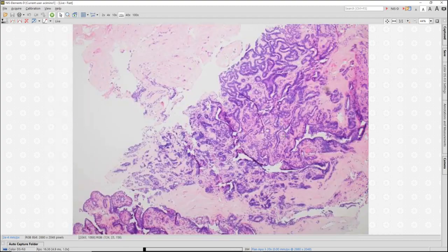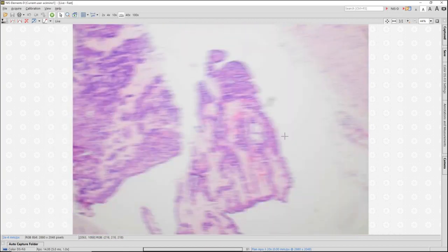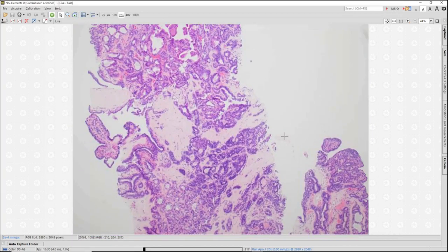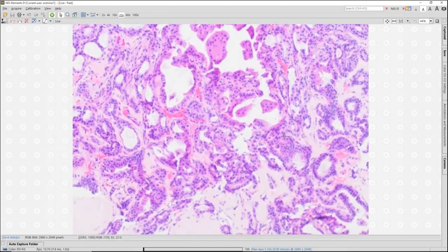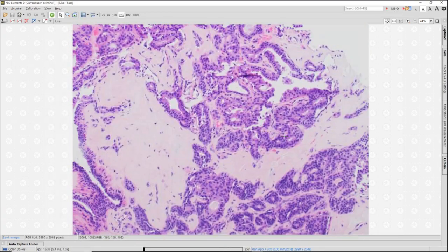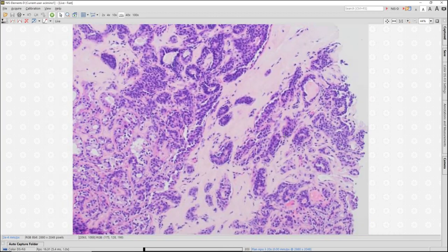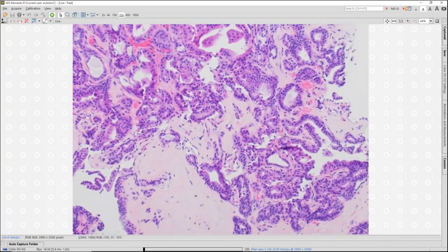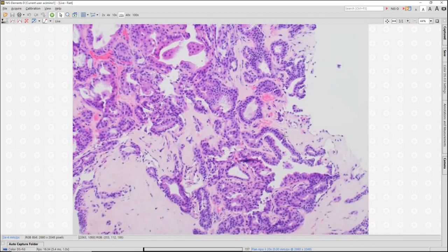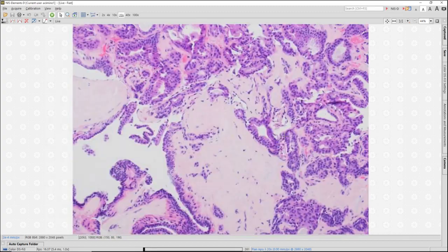This is an example of benign adenosis occurring within the structure of the intraductal papilloma. That's a common change or feature that we'll see involving intraductal papillomas. And again, I like to take a step back and say, okay, what's my underlying architecture, and then layer all of these other things on top of it. And then we realize a quite complex proliferation can be broken down into fairly fundamental components.